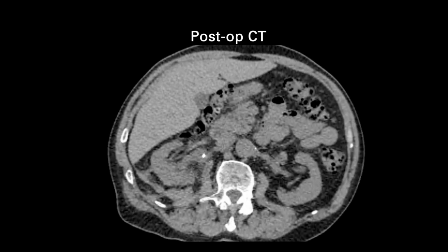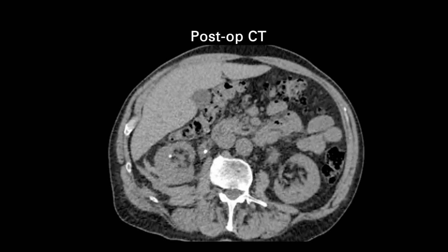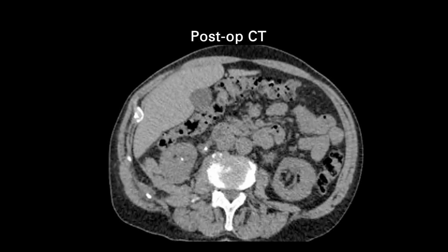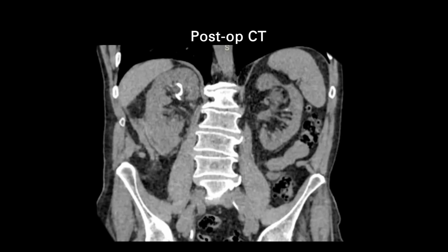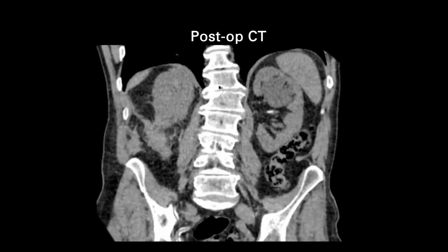He also had treatment in the contralateral kidney at a later session, and there was a stent left in for that afterwards as well. And especially in a teaching hospital setting, I think that doing it this way combines both patient excellence in outcomes as well as it being able to be taught at a high level and having urology residents perform the case and achieving those goals.